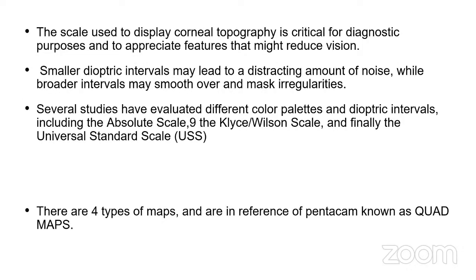The scale used to display corneal topography is critical for diagnostic purposes and to appreciate features that might reduce vision. Smaller dioptric intervals may lead to a distracting amount of noise, while broader intervals may smooth over and mask irregularities. Several studies have evaluated different color palettes and dioptric intervals, including the absolute scale, the Klyce or Wilson scale, and finally the universal standard scale.